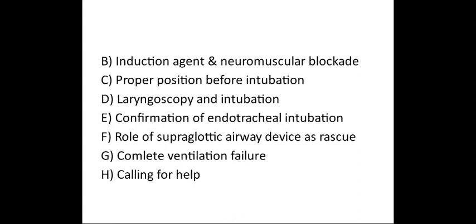Next, proper position during or before intubation. There should be flexion of neck and extension at atlanto-occipital joint. That is the classical sniffing position. That position can be given by keeping a pillow of 10 cm thickness under the head.